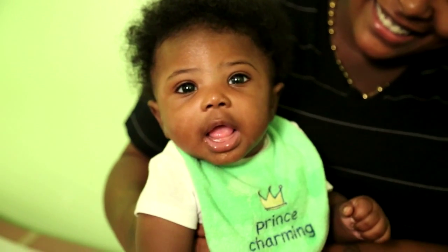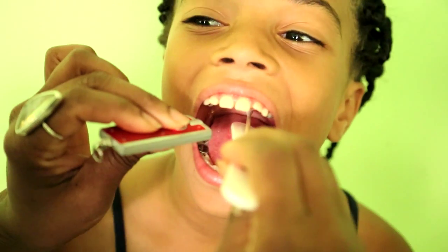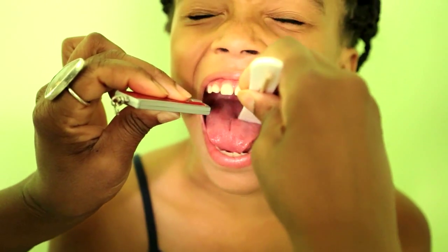I discovered that at times it was very difficult to obtain a throat culture specimen with children, and sometimes with adults, so I came up with an idea that would help practitioners visualize the back of the throat while depressing the tongue and obtain a throat culture specimen at the same time.